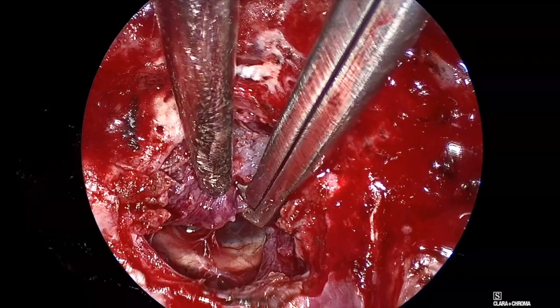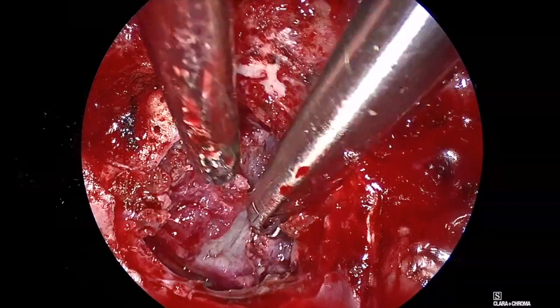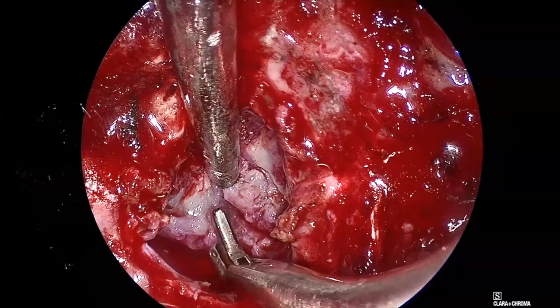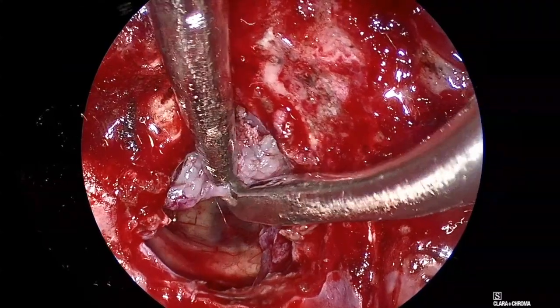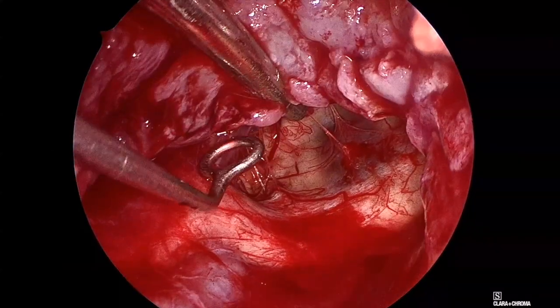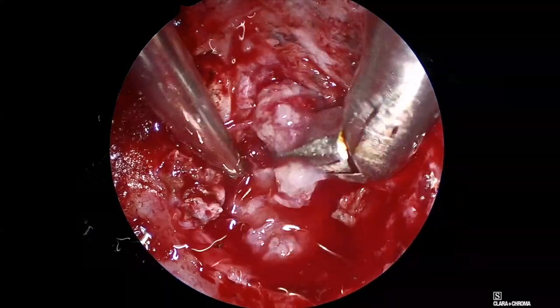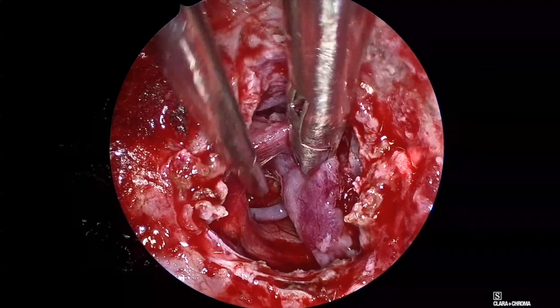As the tumor was too fibrous to undergo extensive early internal decompression, dissection was started meticulously from the postero-inferior pole in the extra-arachnoidal plane using bimanual techniques. The dissected tumor fragments were intermittently excised piecemeal to clear the way towards exposing the optic chiasm and A1 segments of the anterior cerebral artery. Care was taken to protect the perforators. Only after exposing the A1 segments, the dissection was extended circumferentially on either side.